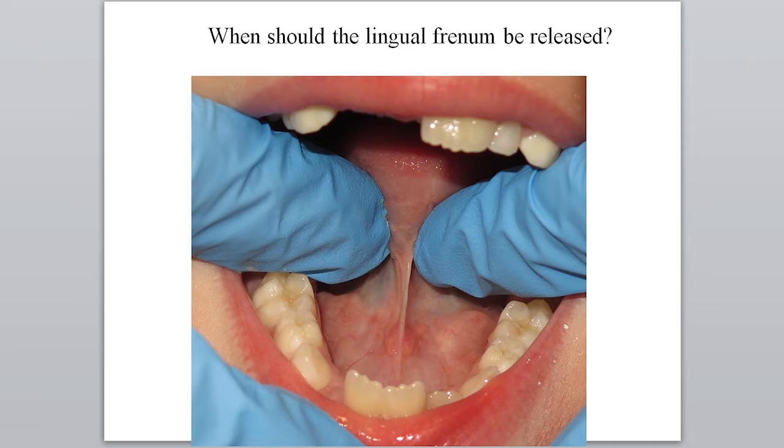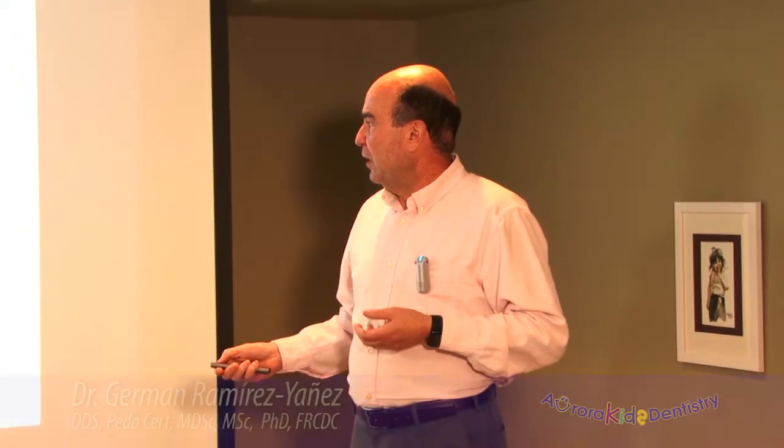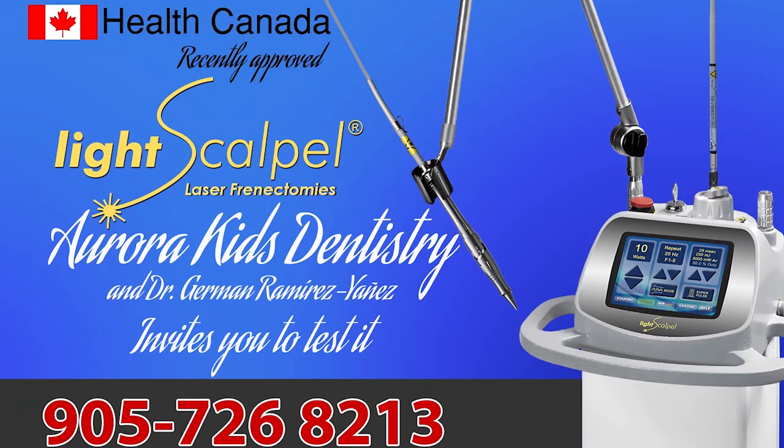So the patient has to close the mouth to be able to bring the tongue to the roof of the mouth. So you see the tightness of the lingual frenum, and we need to do the frenectomy. We can address those cases by doing the frenectomy.